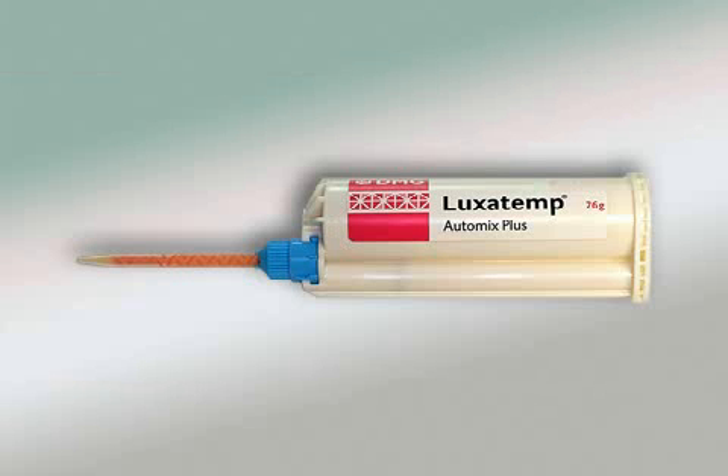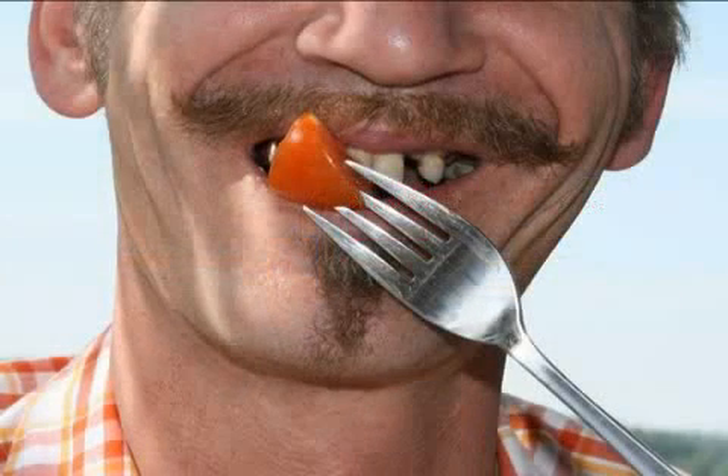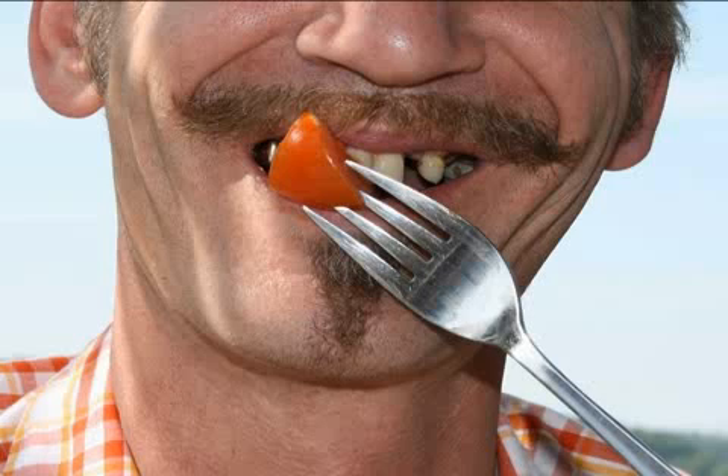Luxatemp is a self-curing synthetic material used in dentistry, primarily for the preparation of temporary dentures. It doesn't matter which type of restoration you expect. Nowadays, you don't have to leave the dentist's office without teeth. Thanks to modern and fast-curing synthetic materials, the dentist can provide a temporary denture immediately.